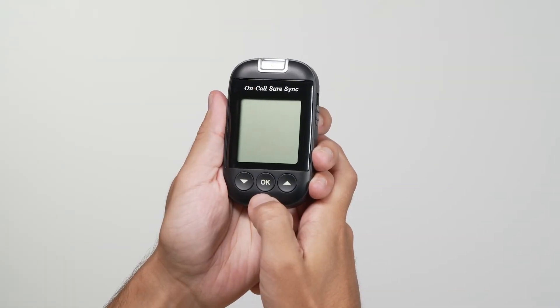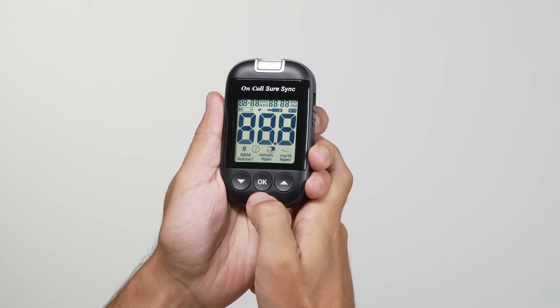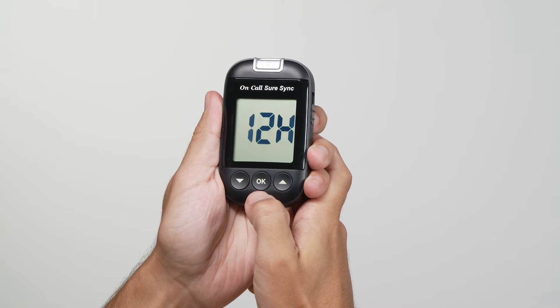Before using your meter for the first time, you will need to adjust the settings. The meter will automatically enter the setup mode when turned on for the first time by any method.